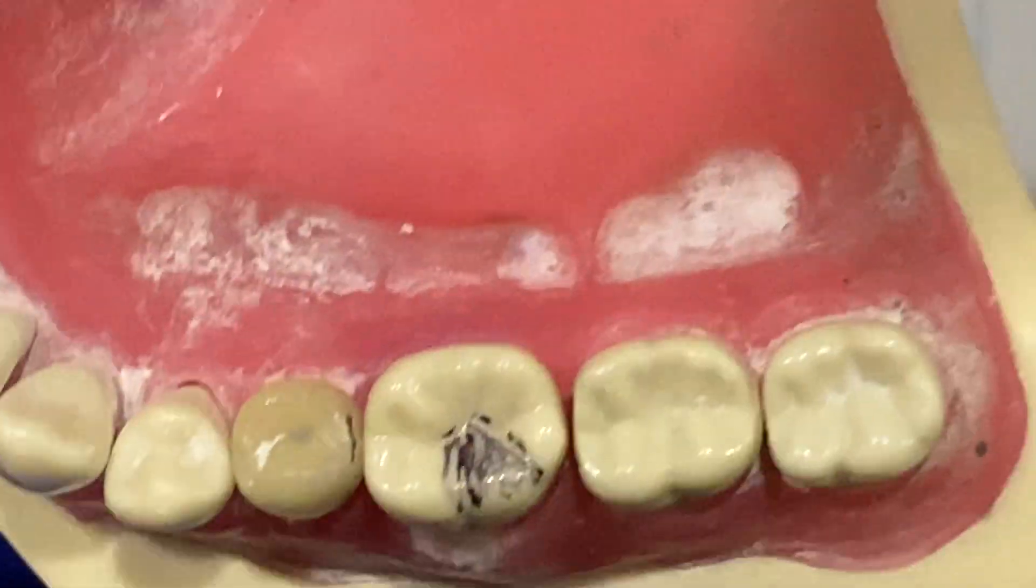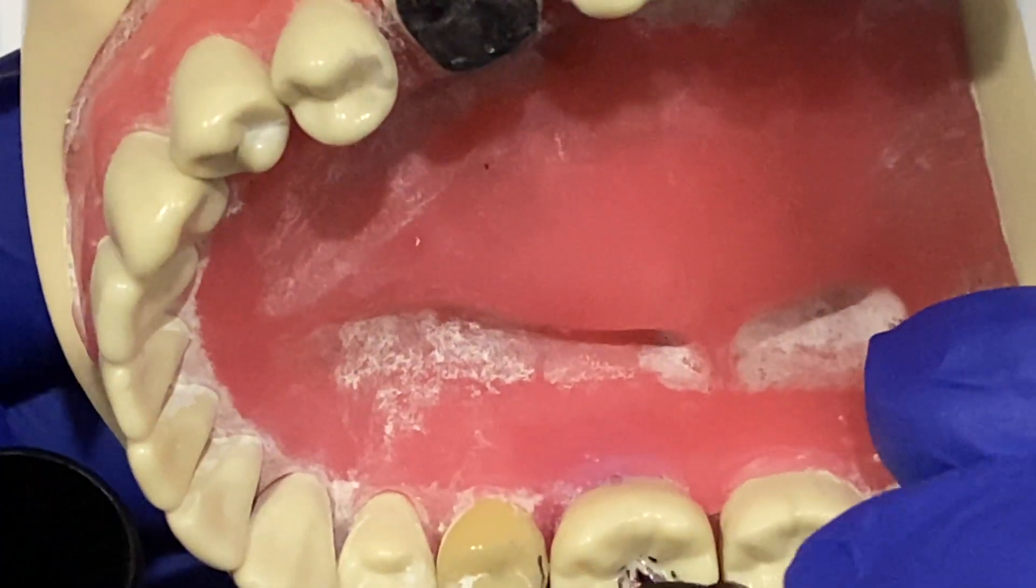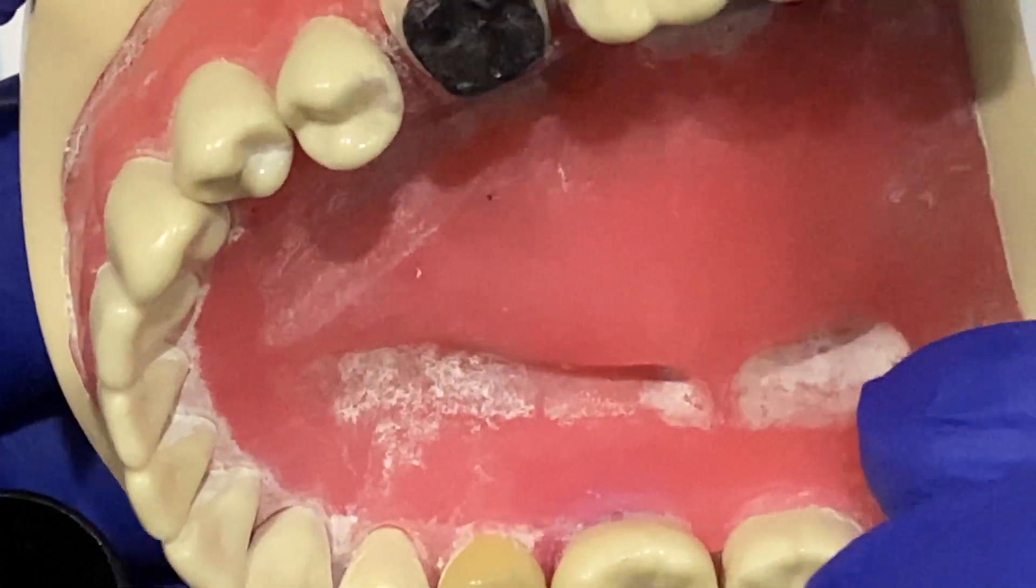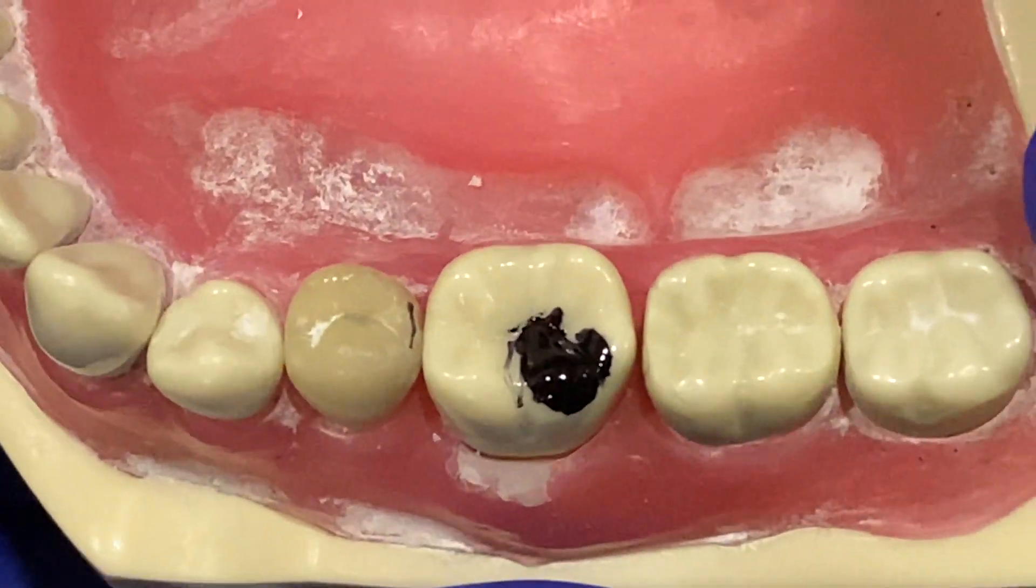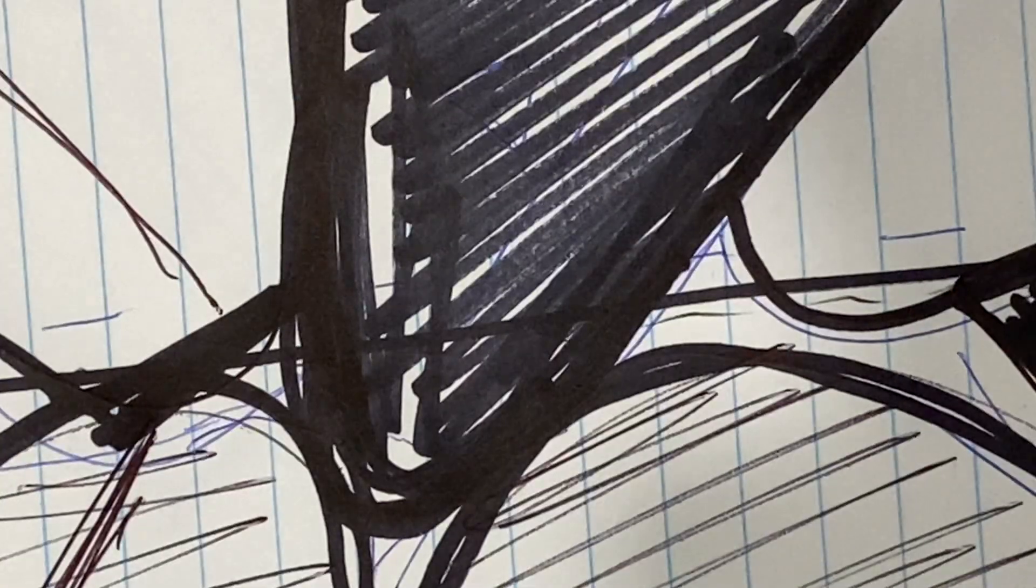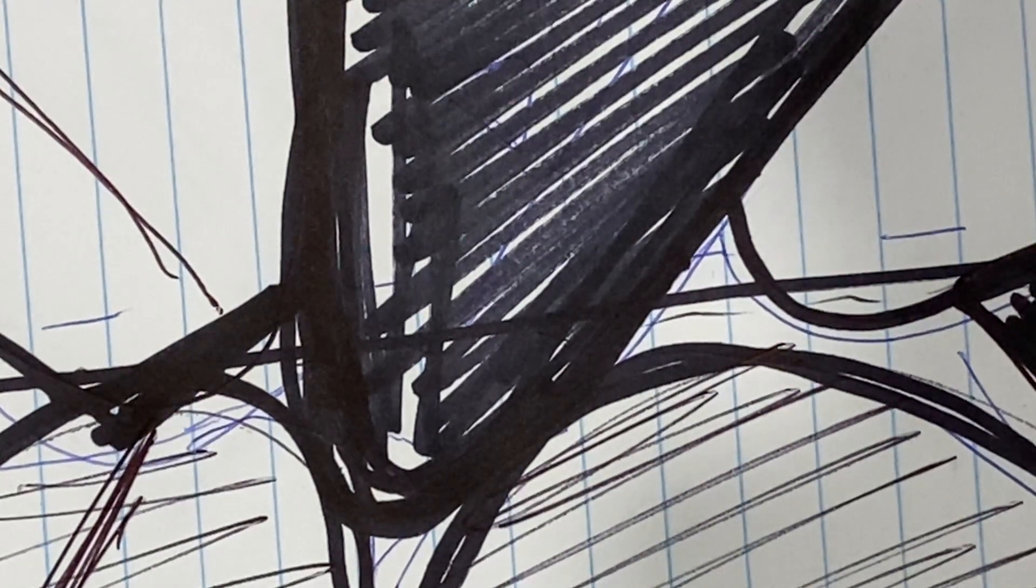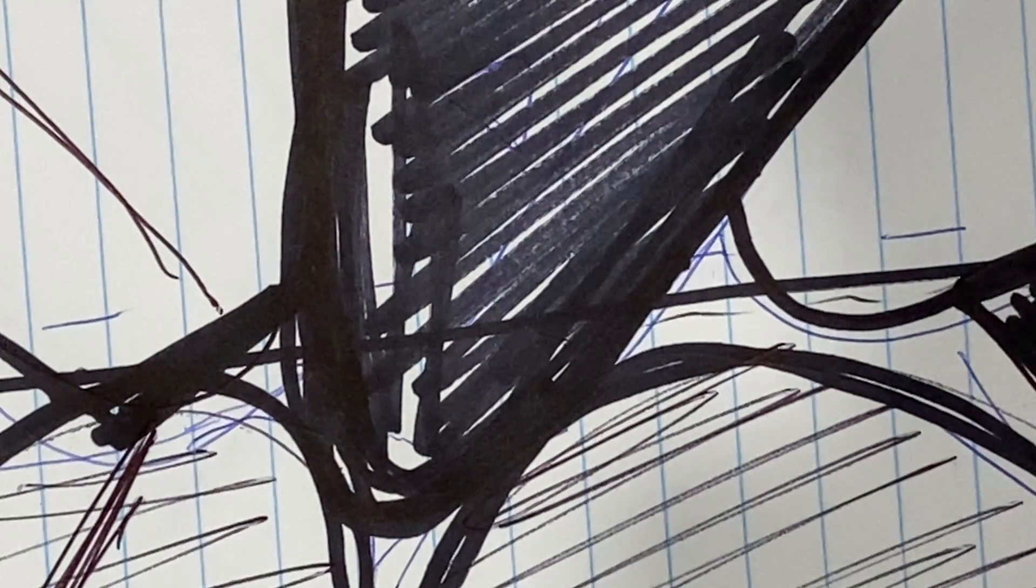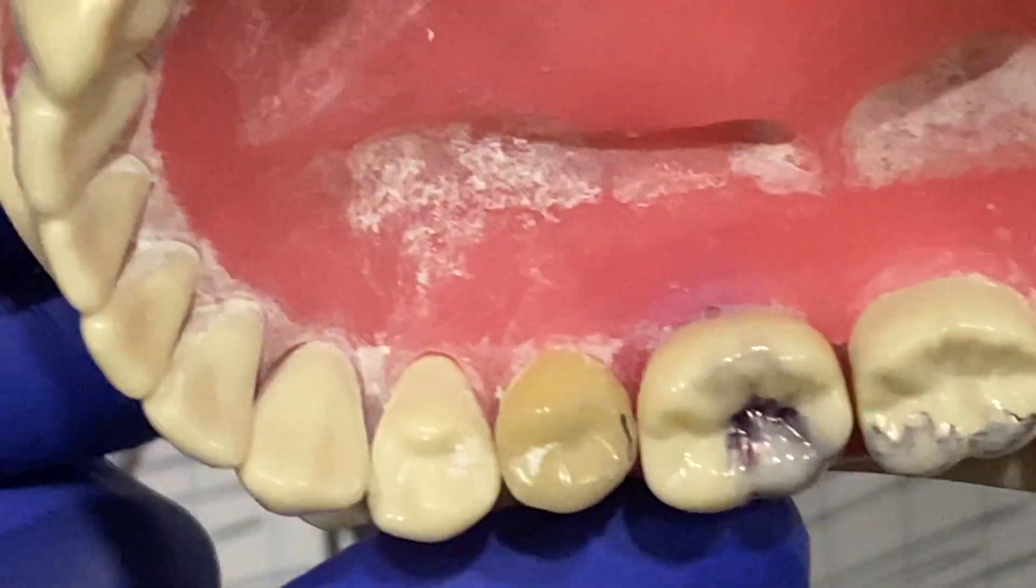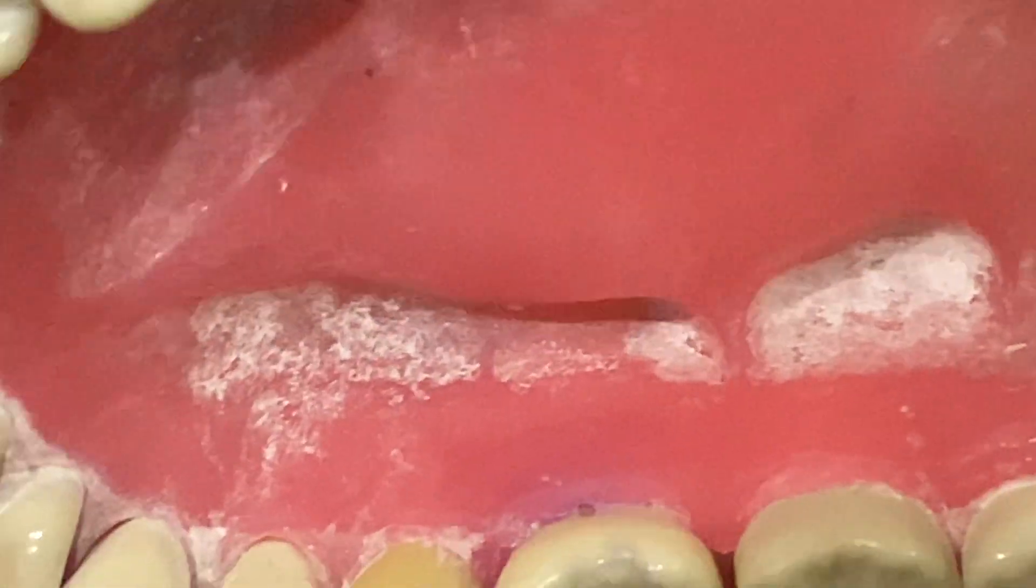If you draw an imaginary line, let me just mark all of that. So if you see the distobuccal, see how much it goes in the center. Look at that.